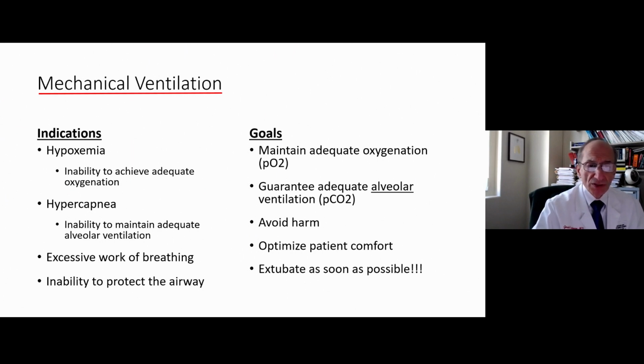For some patients, excessive work of breathing will eventually lead to respiratory muscle failure, and that's a potential catastrophe. And then finally, we do intubate some people and mechanically ventilate them for their inability to manage their airway. So the goals, which is really what we're talking about, is to manage oxygenation and guarantee alveolar ventilation, so PCO2 is maintained. We want to avoid harm, which is one of the guiding principles of what we will talk about in the second talk here.